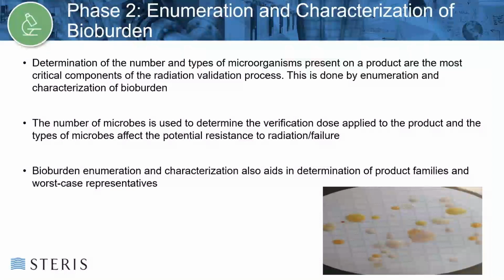Understanding the number and type of microbes are also important factors in the grouping of products into product families, the inclusion of product into an existing family, or the selection of product to represent a product family.